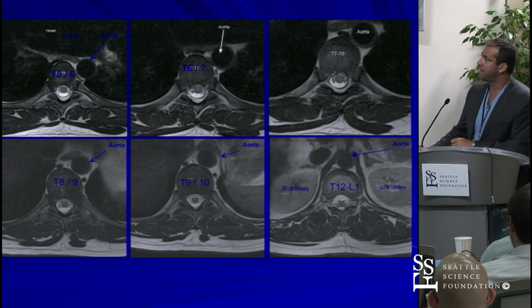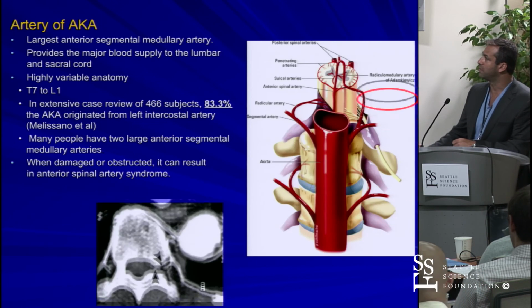You can see here that aorta, right, that is not your friend. And higher up in the thoracic spine, it's sitting in direct access on the left side. You have to have a right-sided approach. Lower down, it starts to move itself anteriorly and central and gets out of the way, and you're more likely to be able to come in from the left side. You got to remember, again, you're dealing with the liver, you're dealing with other organs that we're not particularly adept at working with. So, things to keep in mind as you're performing your surgery.